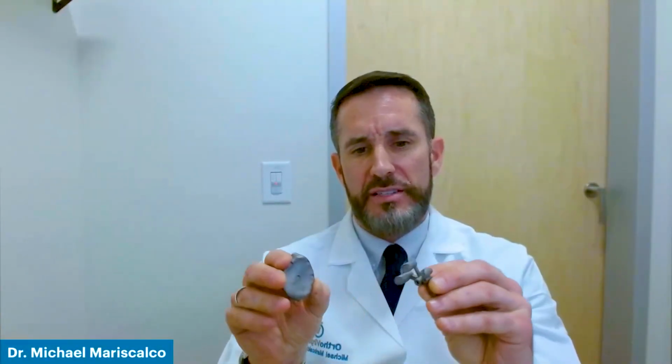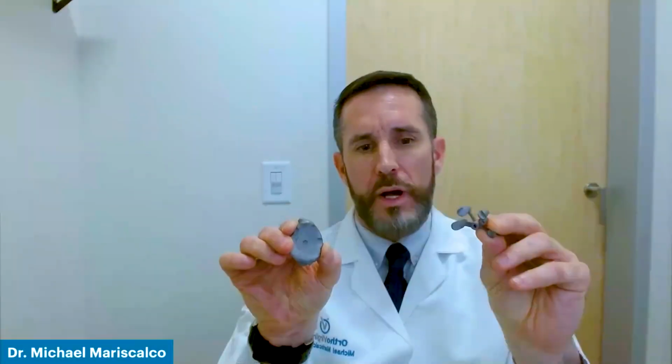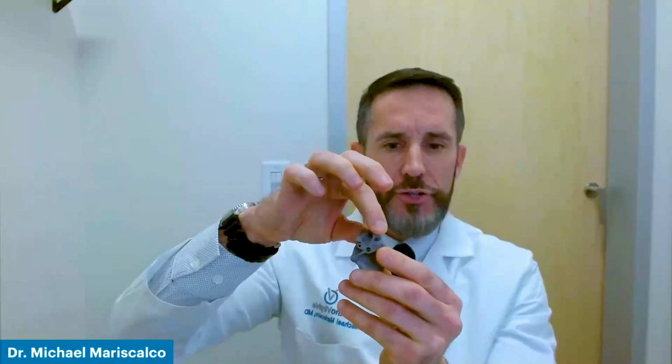So this is a sample of a patient's CT scan, and what this technology is able to do is manufacture a guide that fits over their native glenoid or socket that you can then use at the time of surgery to pinpoint the center part of the socket.